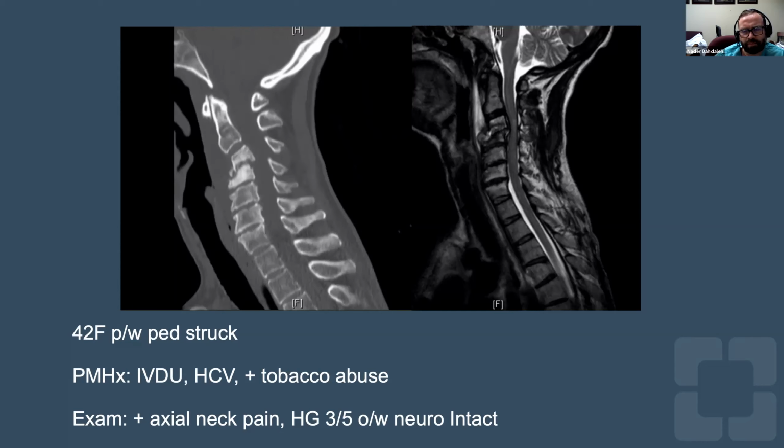So you just back it up, and you're mirroring it. You're not losing more motion segments when you back it from the back, right? Like you're doing corpectomy of C3 and C4, then the plate from C2 to C5, and then you mirror it in the back. So you're not losing more motion segments by backing it up. It just makes it better. Yeah, you're not stiffening this segment more. Would you consider not using a plate for this if you're going to go posterior?